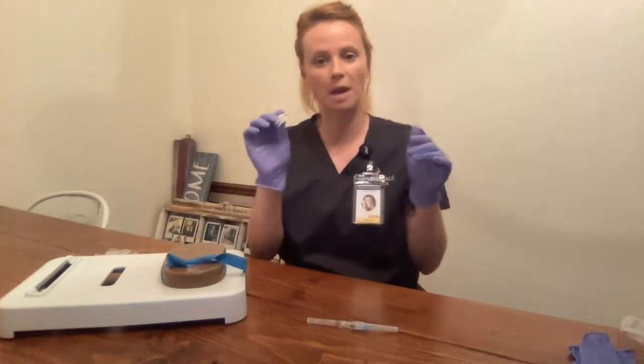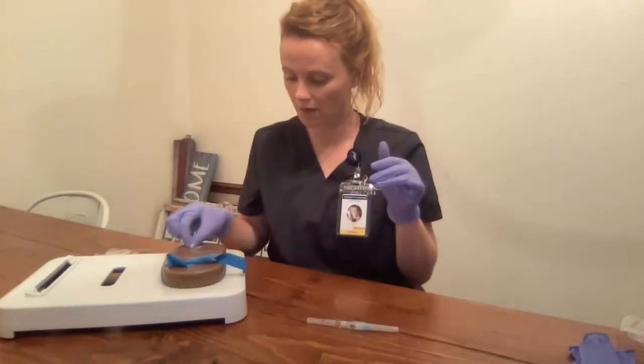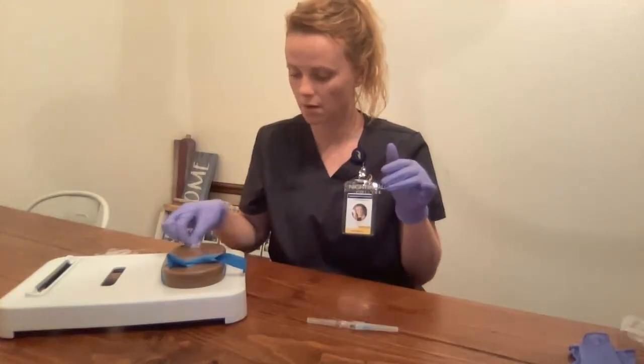I'm going to clean the site using my alcohol swab here, starting at the center and working my way outward. Dispose.